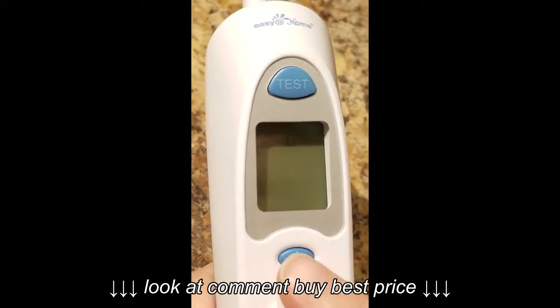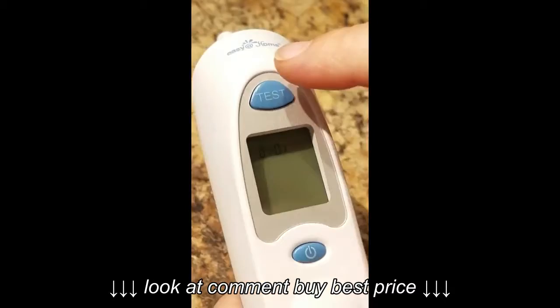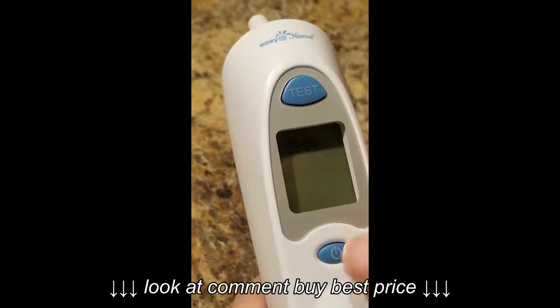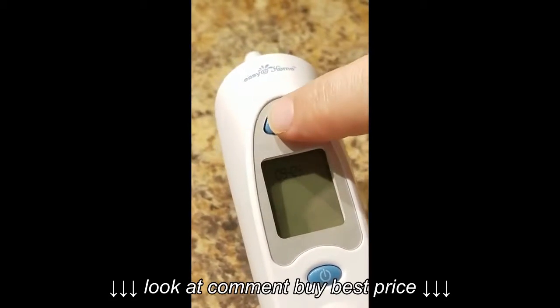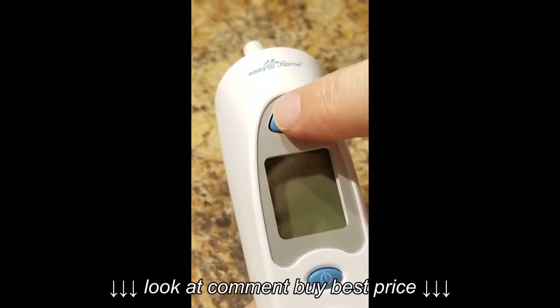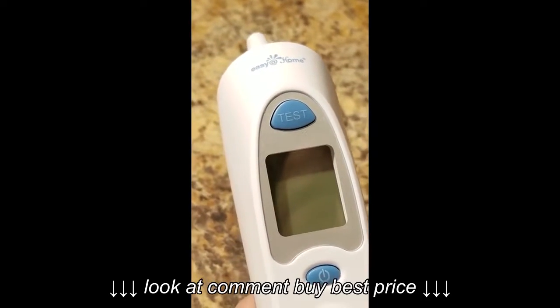it. And then to change the date, it's 9/27, so I'm going to hit the test button to change that to 9 until I get there. Once I've got there, I'm going to hit the power button again, and then I'm going to hit the test button until I get to the correct date, and then hit power again, and you've set the time and date.